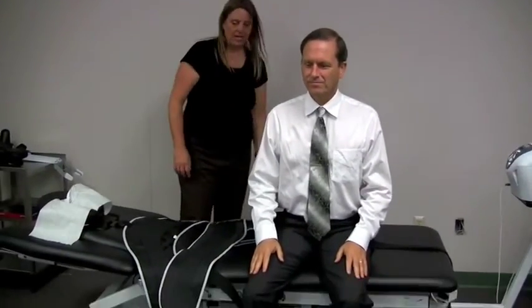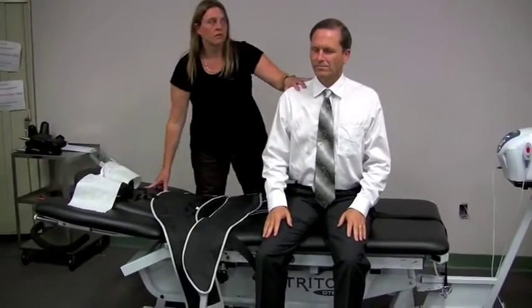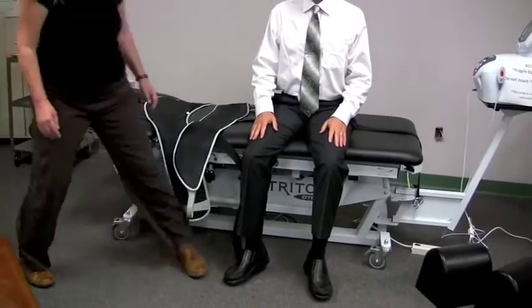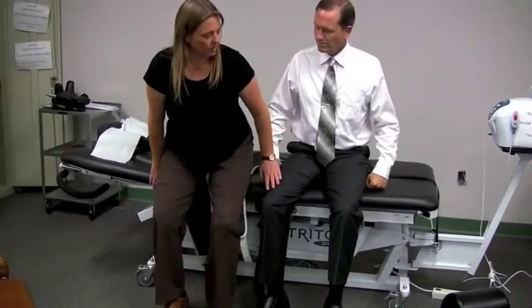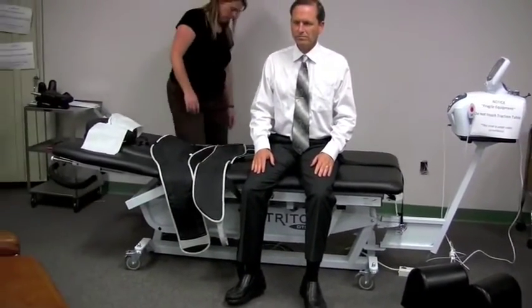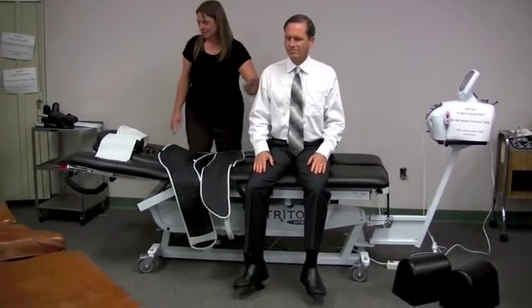And one of the hints about getting a patient off is to actually make the table a little bit higher so his feet are dangling. And so he can slide to the edge of the table. And I'm going to actually bring it a little bit higher so you can easily push off. There we go. Seems funny, make it higher when they're getting off, but it actually works pretty well.